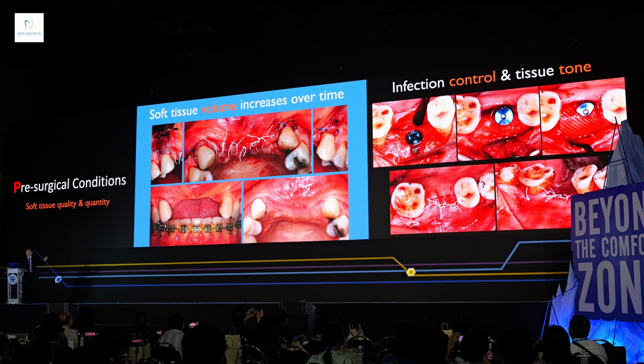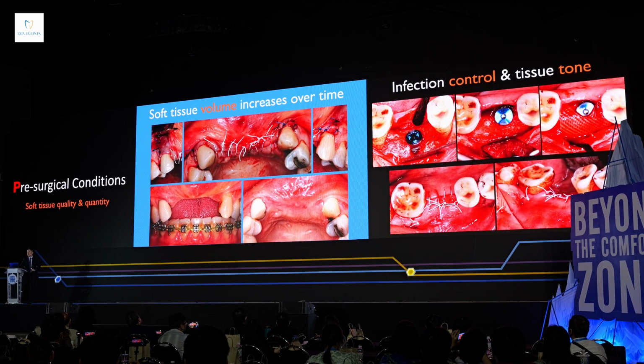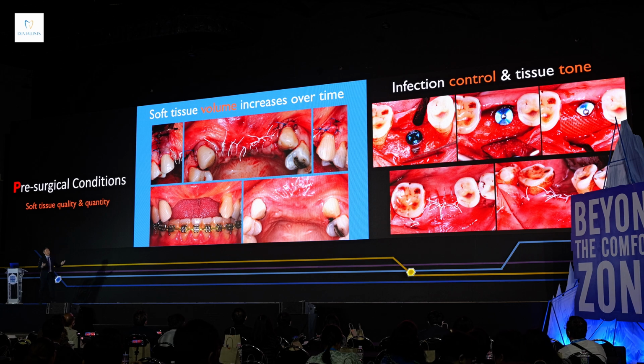Then for the other one, I placed the implant. Whenever the bone matured, I placed the implant and grafted it again. On the other side, at the time of uncovering, I couldn't find the tenting screw, so I had to drill and place the implant. The hole on the buccal is the side where I needed to remove the tenting screw, because it was all buried down there. In order to remove it, I had to dig it out. But when you look at the bone augmentation, it's quite successful.